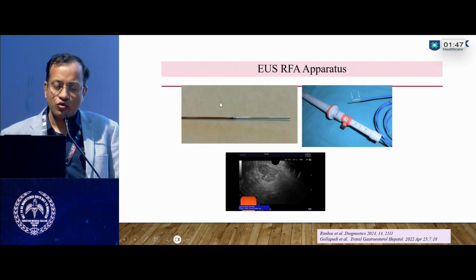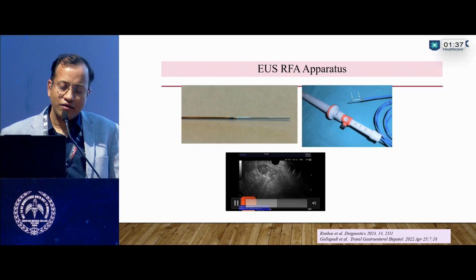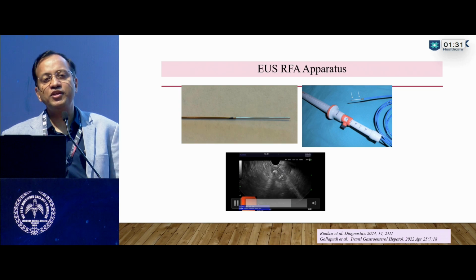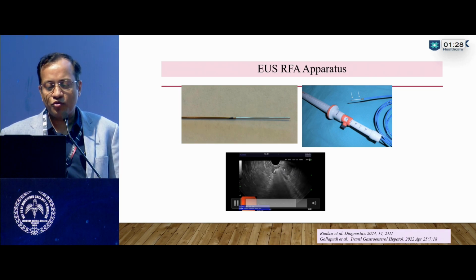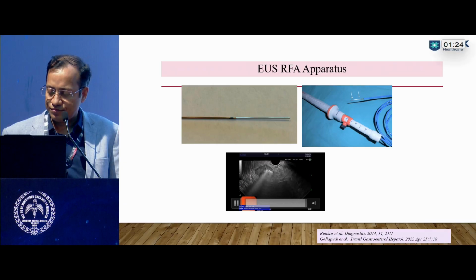Yeah. So we go to the distal part of the lesion, then we apply 30 to 50 watts of energy, and we see a cloud there. And in one session, the whole lesion can be obliterated. After that, imaging should be advised, and we should look for any viable area, and the procedure can be repeated after 3 months.